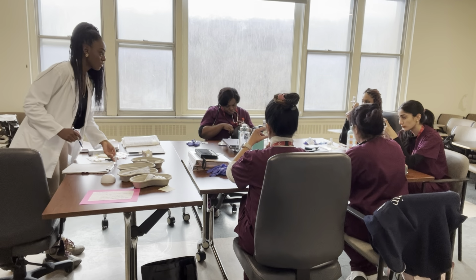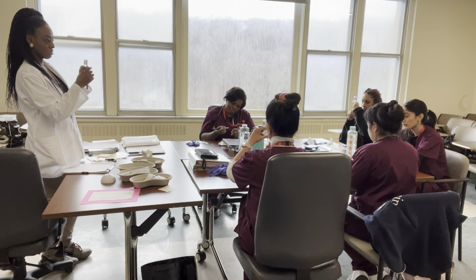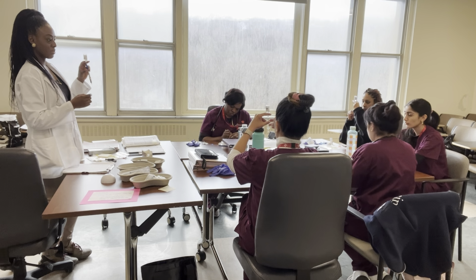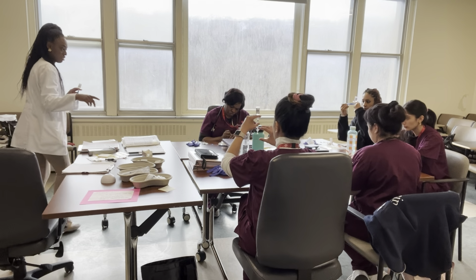Good, so all your fingers are holding it. And then, Jasmine, again, your fingers should be around the neck of the vial. So where's the neck of your vial? There we go. Those are 2 fingers. Now it's more stable so that you won't bend the needle, because if you bend the needle, you have to restart the whole process. So let me see your fingers. That looks good.